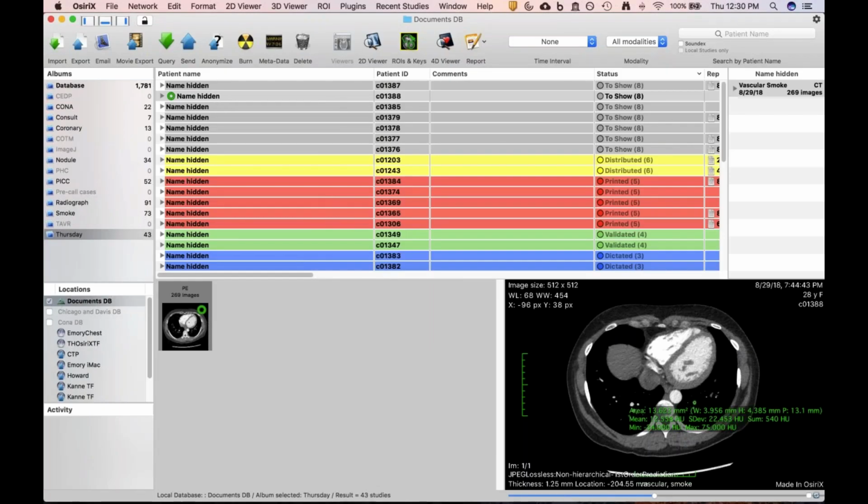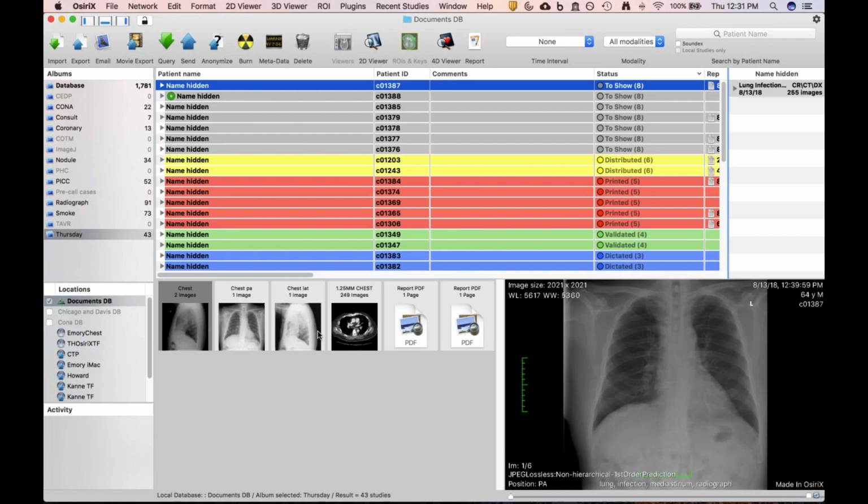Interesting. You would think if that was thrombus on the venous side, she'd be having embolic phenomena somewhere. Right. Well, that was why I wondered if it would actually be relevant to do a repeat study just to make sure, if it would change management. You could do a nuclear medicine scan, maybe. I don't know if that would. Yeah, or I was thinking just repeat with delayed. Unfortunately, they didn't do an abdomen and pelvis CT or anything else at the time.